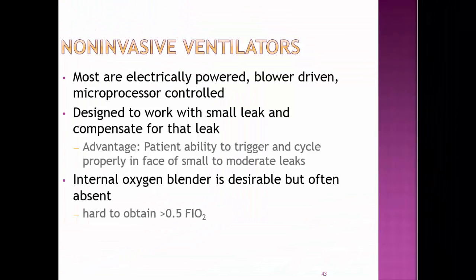Now for the non-invasive ventilators themselves. Most are electrically powered. They're blower driven. In other words, you don't have to plug them into the wall to get pressure. Just plug them into the electrical outlet, and they're microprocessor controlled. These are designed to work with a small leak and compensate for that leak, and in fact most of them require that you have a leak.